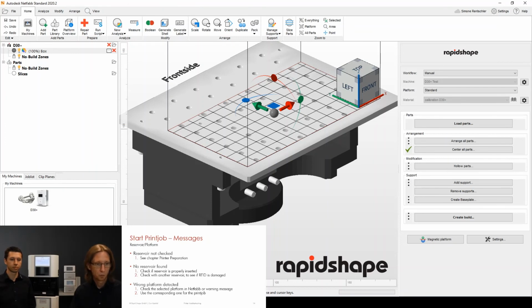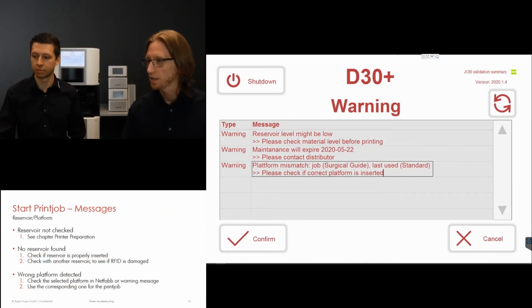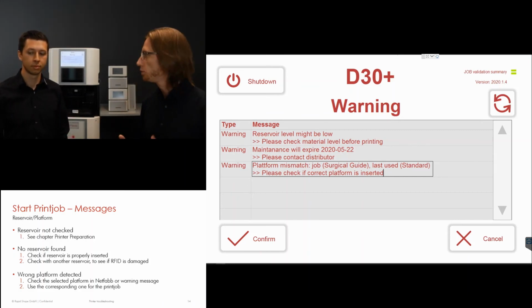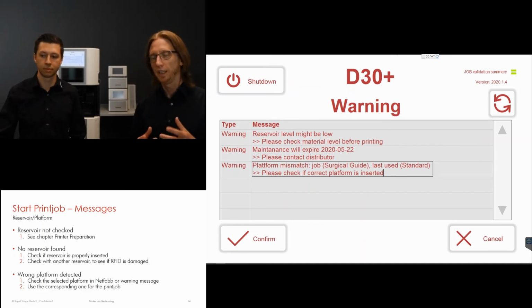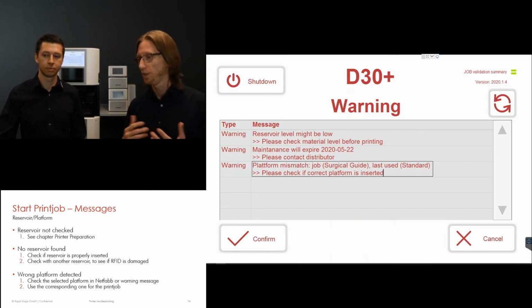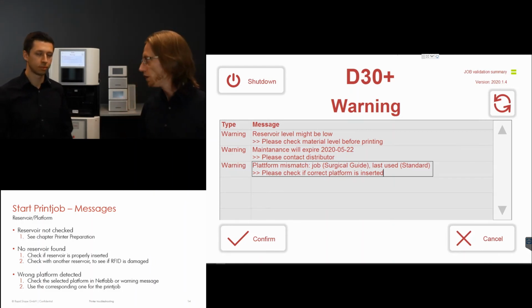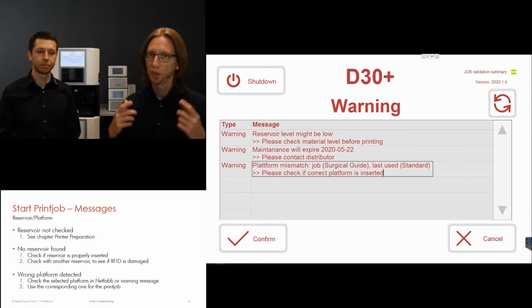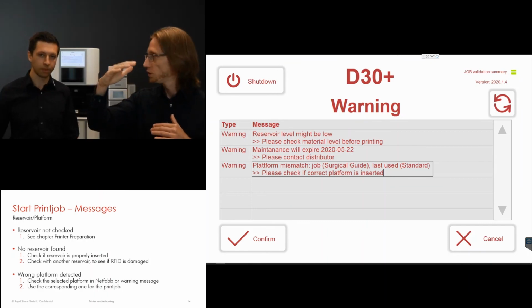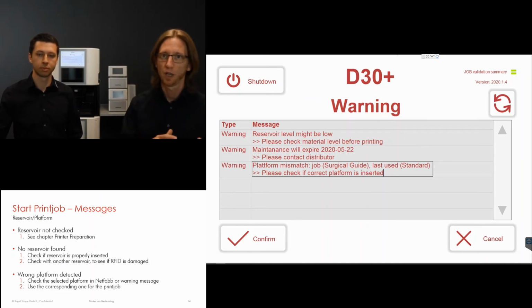So let me go back with the TeamViewer right here. Just a second, please. So this is what we got. And if you made sure that the platform is correct, you can confirm and start the job. The machine will additionally detect, when it has performed the fine zero movement, if this is really the correct platform, yes or no. It detects it by a certain difference in height of the platform. The surgical platform is a little bit taller than the regular platform, and the machine can detect the distance from top position to bottom position, and if there is a certain deviation, it recognizes that this must be either the surgical guide or the standard platform.